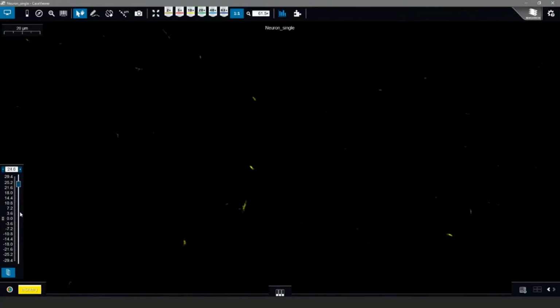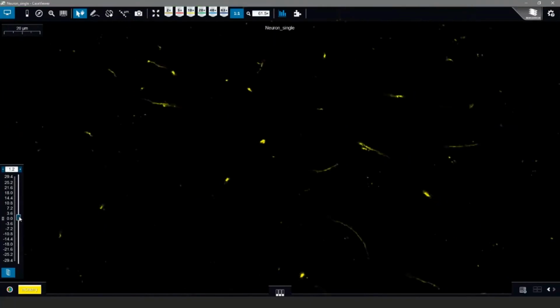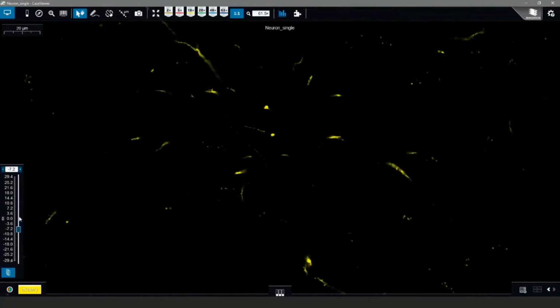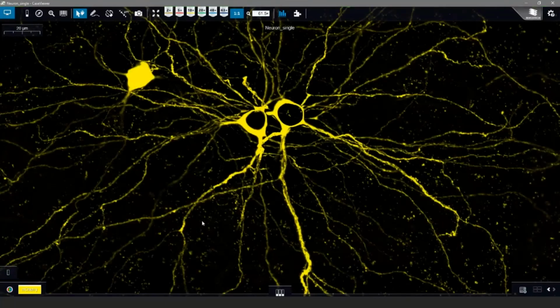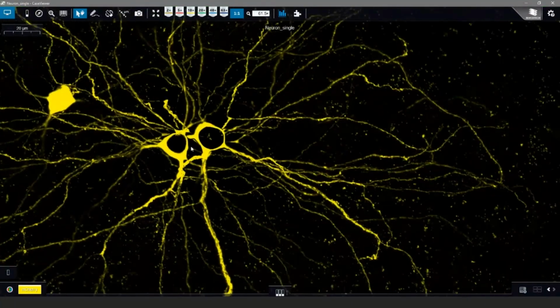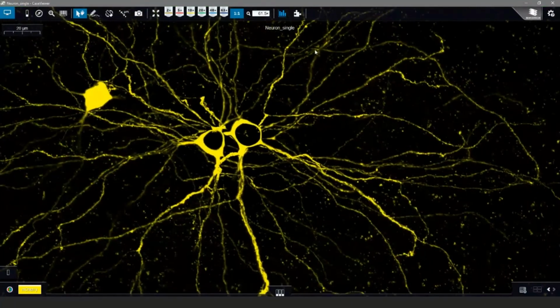Anyway, you can change between these layers manually if you would like, if you have a digital slide with multiple layers, and you can also see the whole image in the extended focus view. If we are on the whole image, we can also start our three-dimensional reconstruction software.